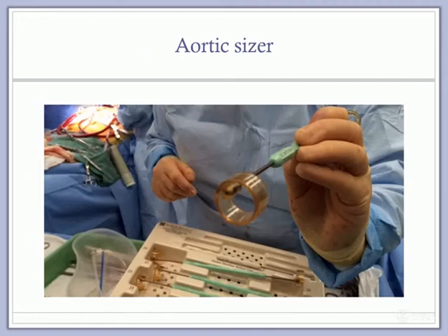Fortunately, surgeons don't have to rely on our sizing. They have these sizes provided by the valve companies. Different companies have sizes which don't exactly match, a bit like clothes sizes in department stores. Maybe they want the surgeon to think he has put in a bigger valve than he expected to because he used one of theirs.